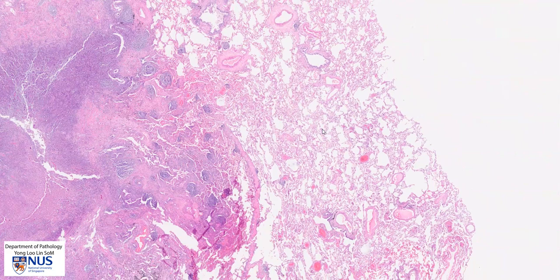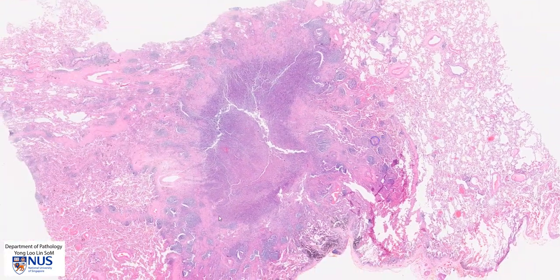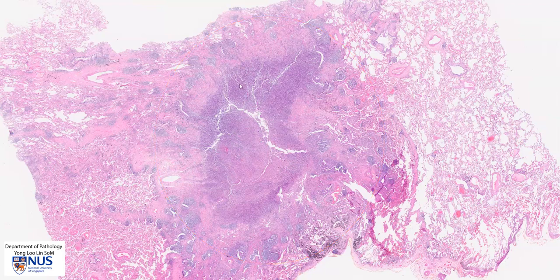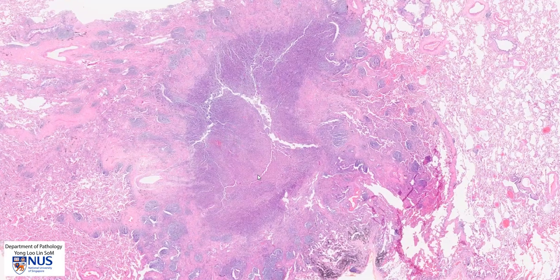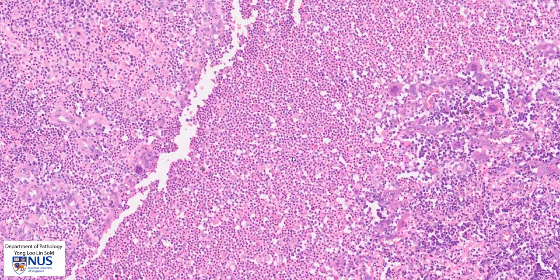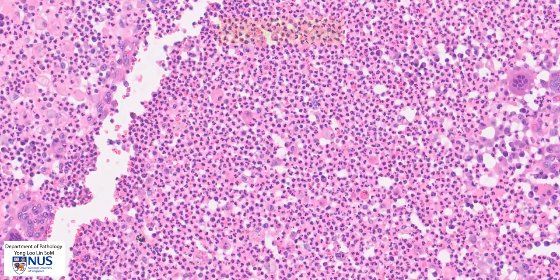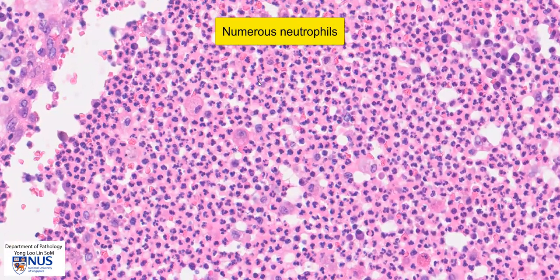Now let's move to the abnormal area. There are some lymphoid aggregates around, but the main area of abnormality is here. We can see that there is a pinkish area with a slightly more blue surrounding cuff. Zooming in on this pinkish area, we can see that there are numerous neutrophils, and we can recognize these by the multi-lobed nuclei.